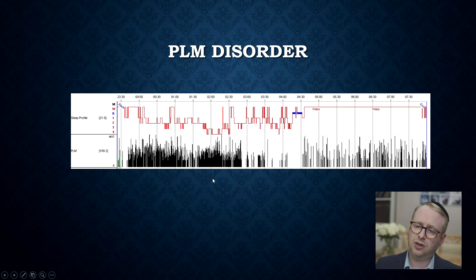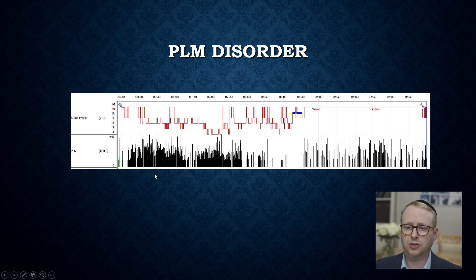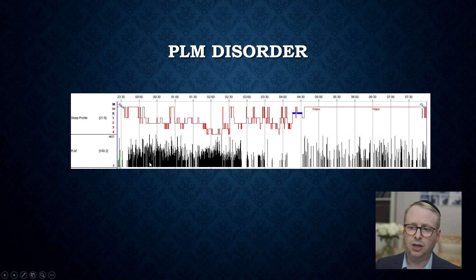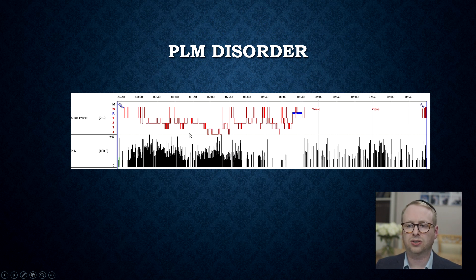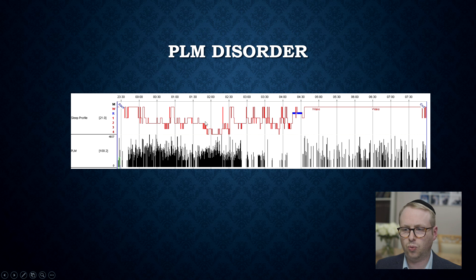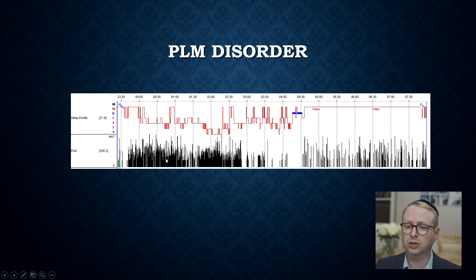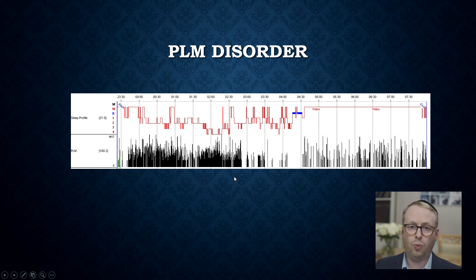This is another type of sleep disturbance called periodic leg movements disorder, where people are vigorously moving their legs. This is the count of the leg movements over here. You can see that they're not able to enter into slow-wave sleep until much later in the evening, and only for a short period of time — most of the time in stage one or stage two sleep, because they've been constantly awoken by their legs moving.